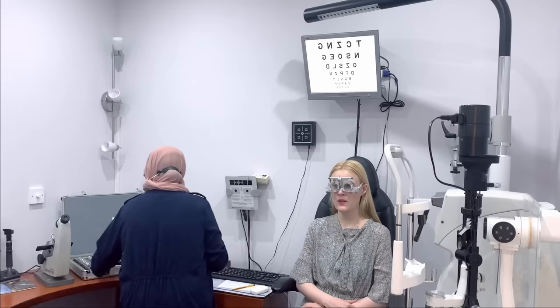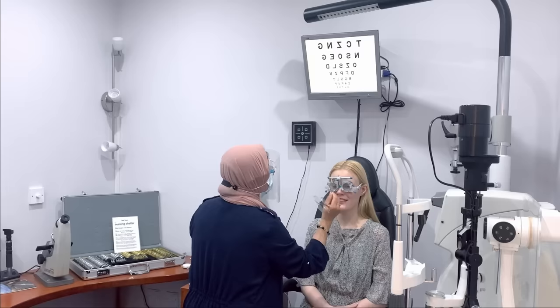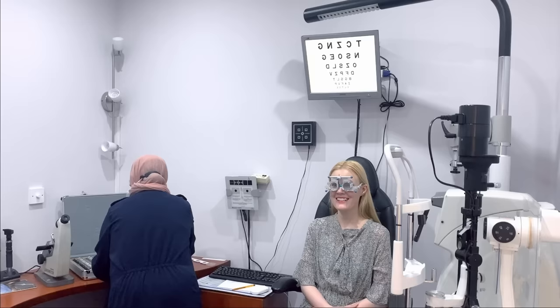So I'm going to place another lens in. Okay. Ready? Yeah? Yeah. And again, better with or without? Without. This time, yeah? And then with both your eyes, that's pretty good there, isn't it? Wow. Nice and sharp, yeah? Yeah, it's so sharp. Right, so let me make a note of that, okay?